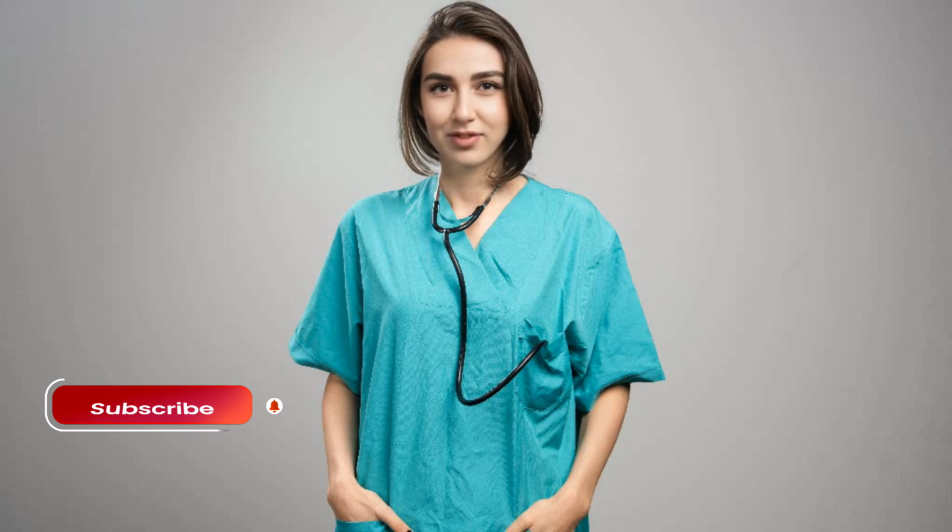2. Catheter insertion. A thin, flexible tube, catheter, is inserted through a small incision at the insertion site. The catheter is carefully guided through blood vessels to the heart using fluoroscopy, continuous X-ray imaging.